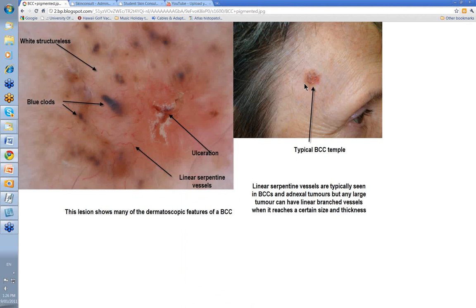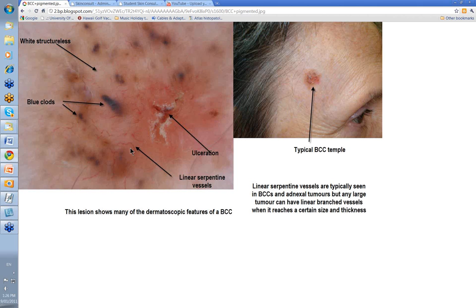Here's a clinical lesion with pink areas and bluey-black areas. When you look at it with the dermatoscope, these are your blue clods — there are several others scattered through this. This is a white structureless area that's part of that pearly background colour you see in BCCs. These are linear serpentine vessels — there are some branched bits here. And this is a little area of ulceration, corresponding to this area on the lesion.